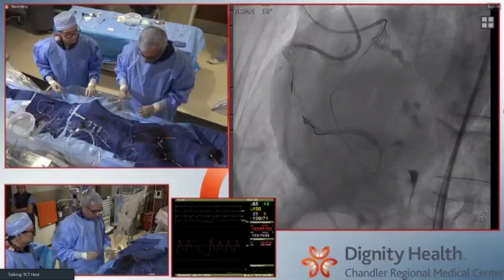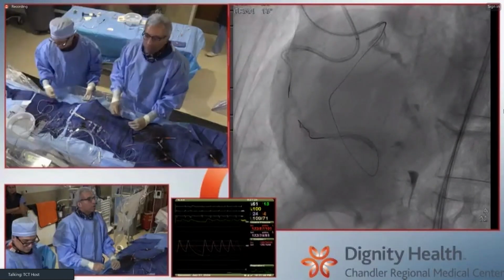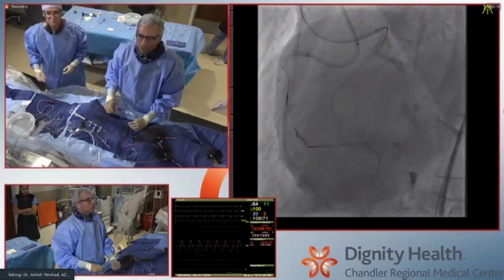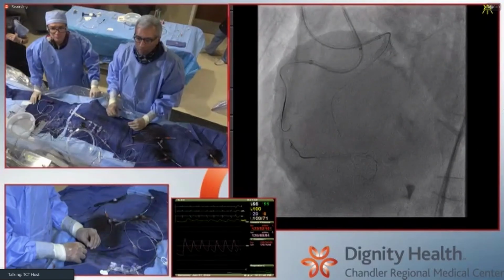So Dr. Varghese, are you going to take a similar sort of Pilot 200 type wire antegrade, or are you going to go with something a little bit more penetrative? Yeah, probably I think take a Pilot type wire, make a loop from both, and like Sir said, probably a reverse CART.